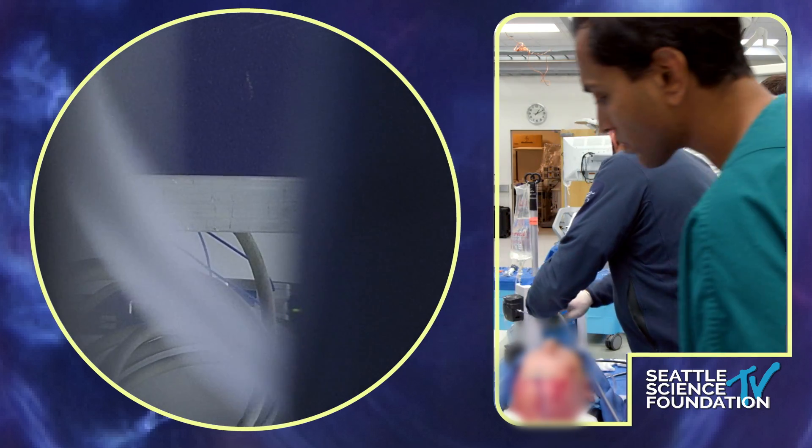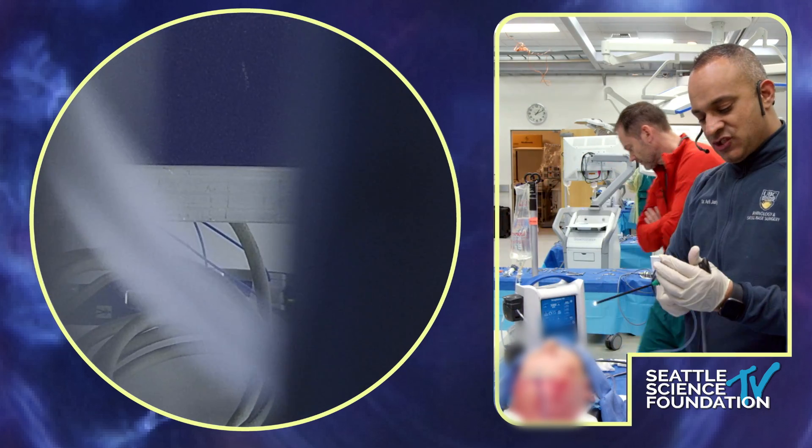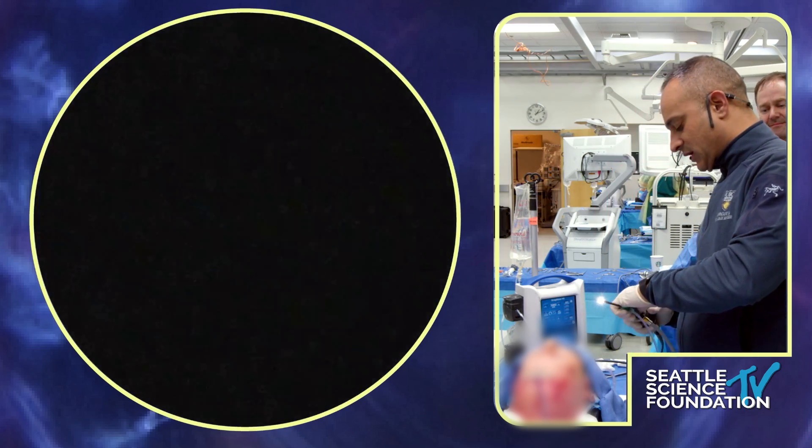I have put a lens cleaning system on my 30-degree scope and I'm just trying to find it. I had to jury-rig it because it was for a different scope, but I wanted to show you what I do use in the actual OR.